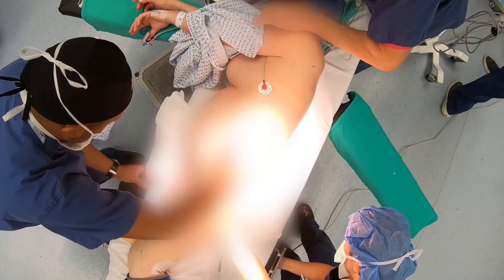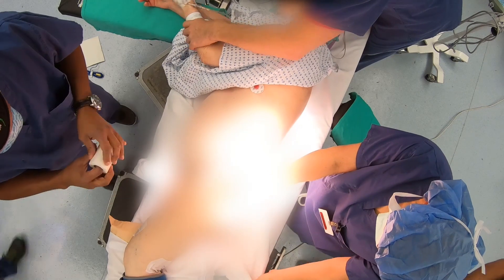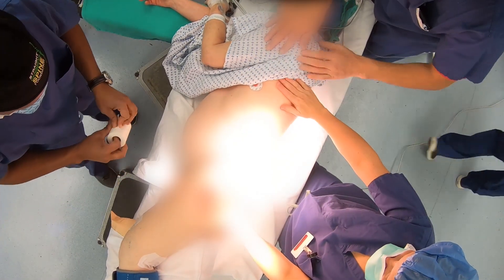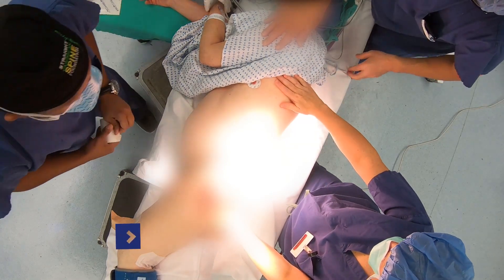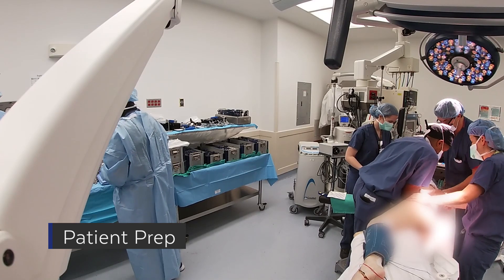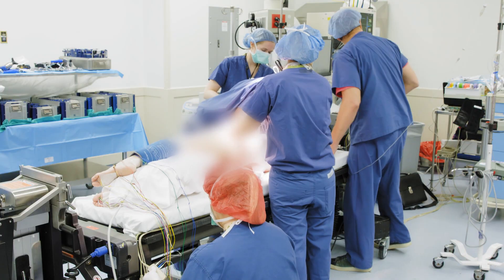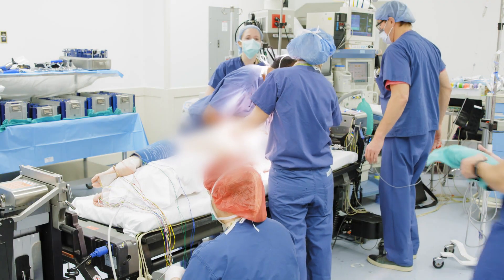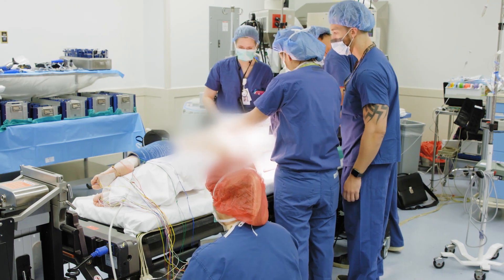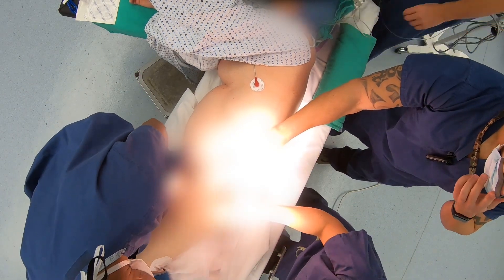What you see here is positioning of the patient in the lateral position. We're careful to make sure that they're far enough anterior to allow the belly to hang and get out of the way of the lateral procedure, but they're posterior enough so it does not interfere with the placement of the downside contralateral screws, typically on the right side.